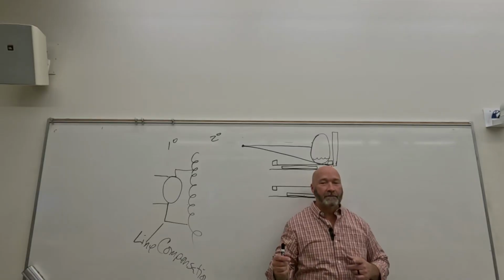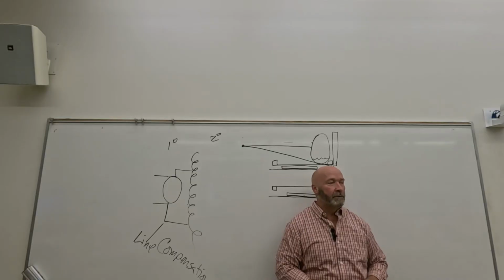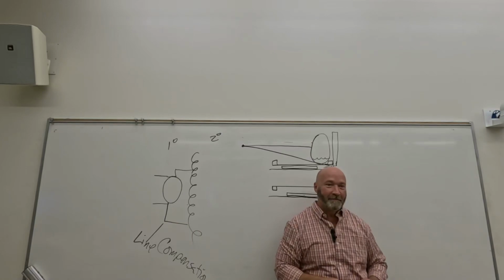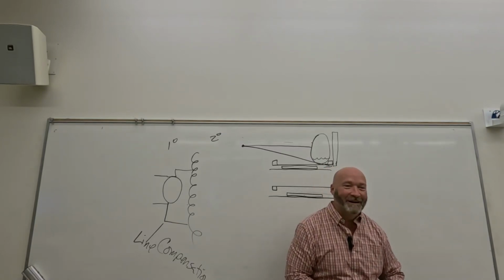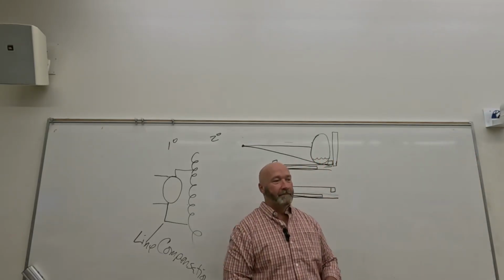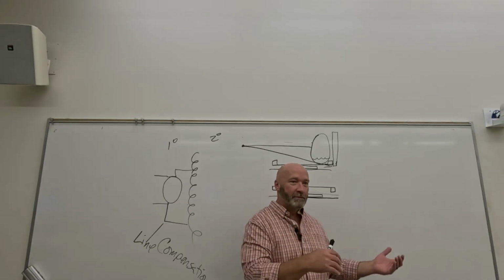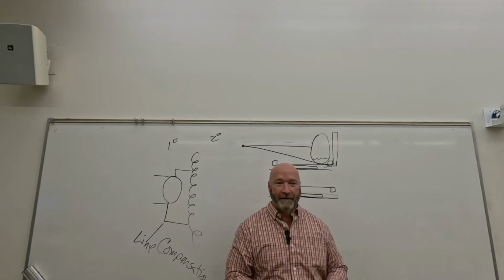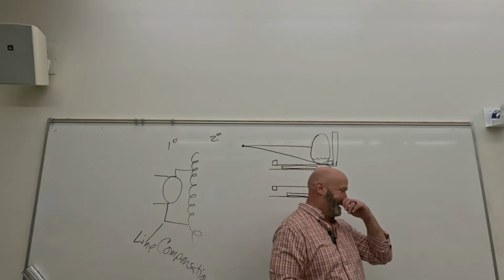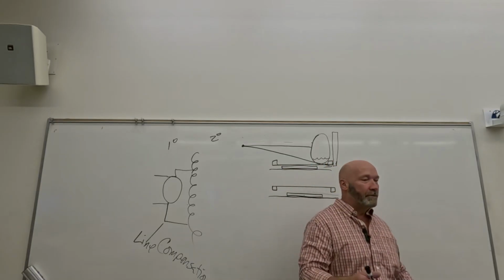Okay, now apply that to some of the fluoro exams that you've done. Anybody done a cervical myelogram? What do you do with a cervical myelogram? You tilt the table, bingo. So if you've got a tabletop that has a tendency to move if you have some sort of pressure on it, and you put a patient on it, and you tilt that table, where's that patient going? Yeah, exactly. Straight into the floor. So we have to have something a little more stable, sturdy than that.